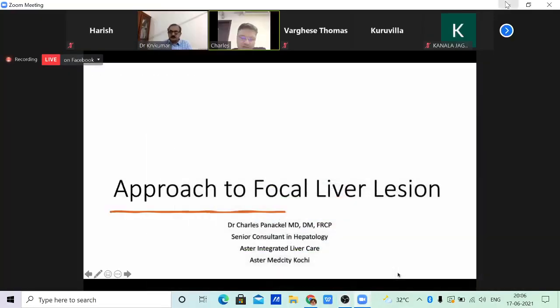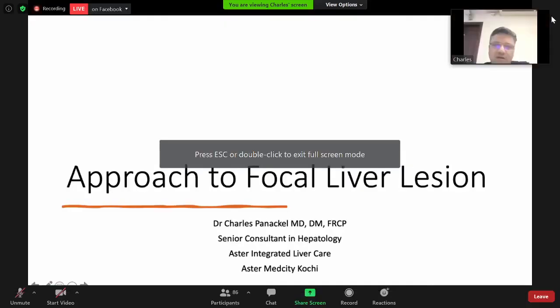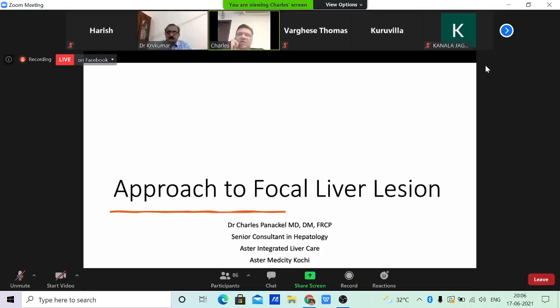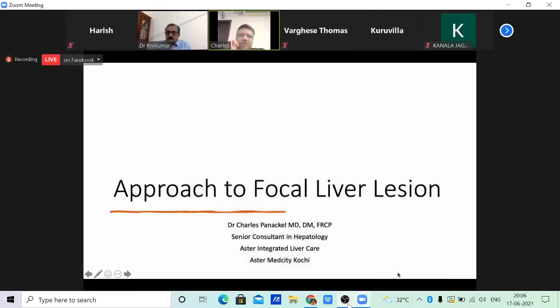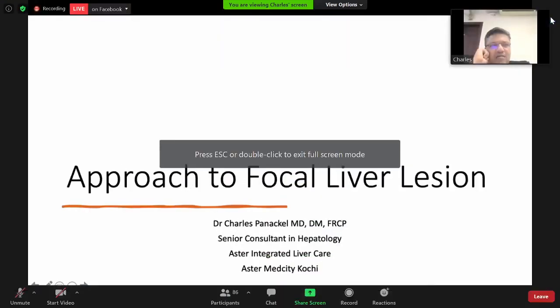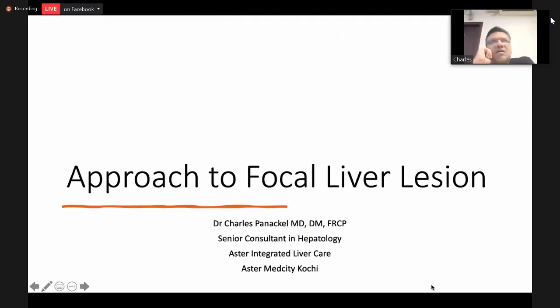Good evening, all. Today I'll be discussing with you the approach to focal liver lesions. As you know, with more and more ultrasounds, CTs, and MRIs being done, the pickup of incidentalomas is on the rise. Today I'll be approaching focal liver lesions in patients without underlying chronic liver disease and focal liver lesions in patients with underlying chronic liver disease.